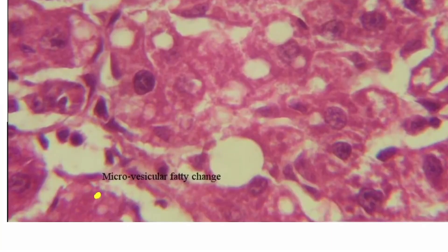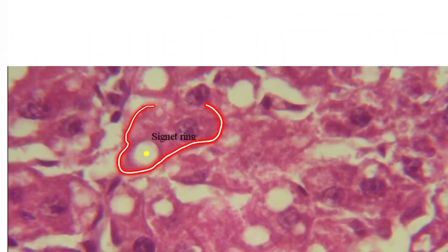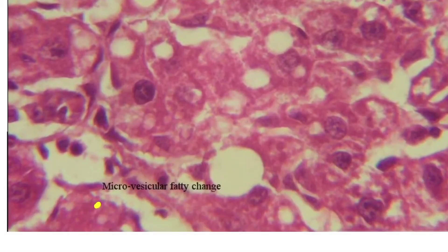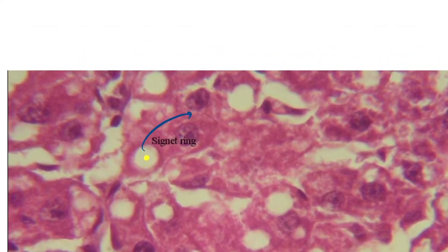Here you can see this cell has a small droplet of fat deposited - this is called microvesicular fatty change. But here in this cell, there is a big portion of fat, and this is called macrovesicular fatty change, because of the larger size.